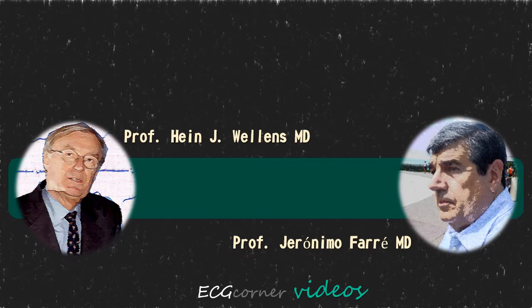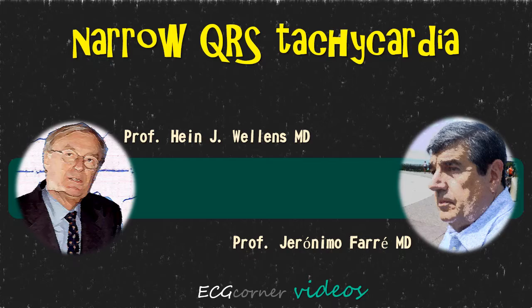Hello, I am Geronimo Farré, and in this video, Professor Wellens and myself want to discuss with you a case of narrow QRS tachycardia.